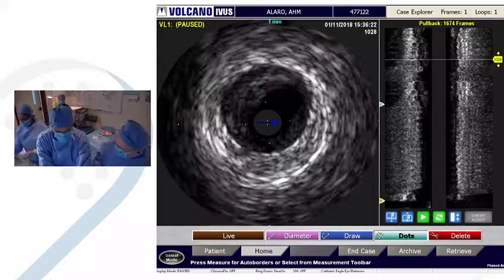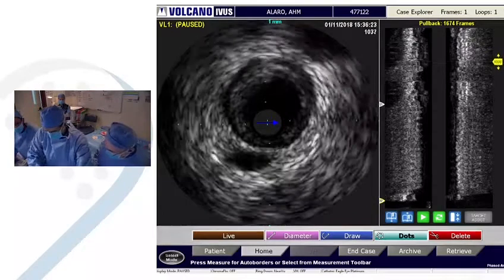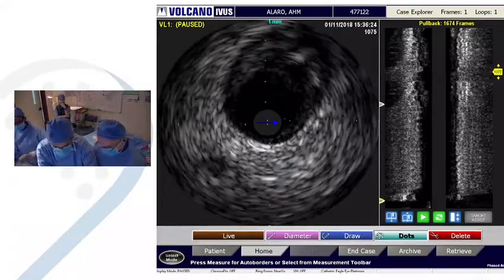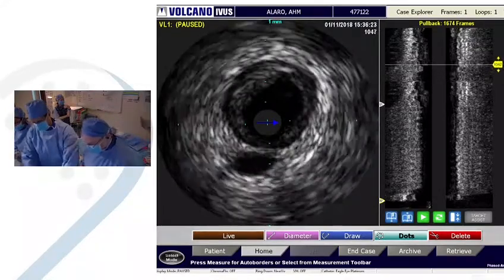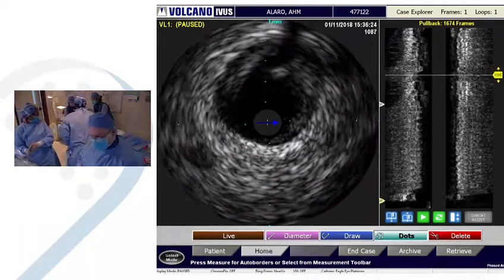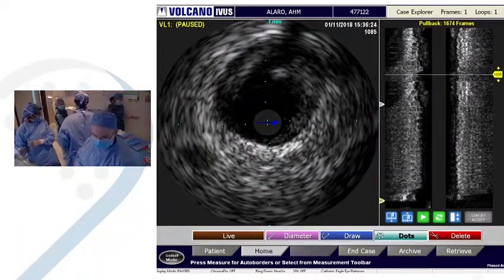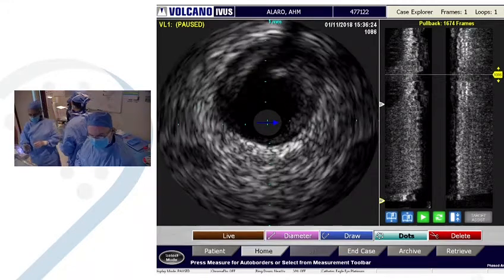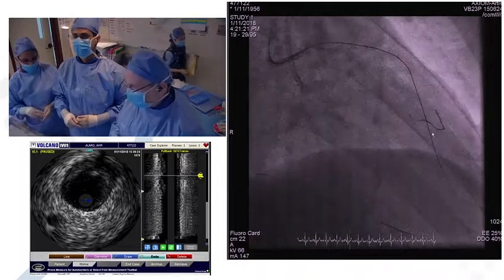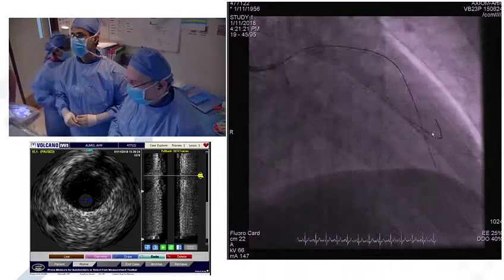Just open up the struts towards the circ. Okay, so not so spectacular, but I think the result hopefully will help the patient who was symptomatic on the table every time the left main was engaged or the right was dilated.